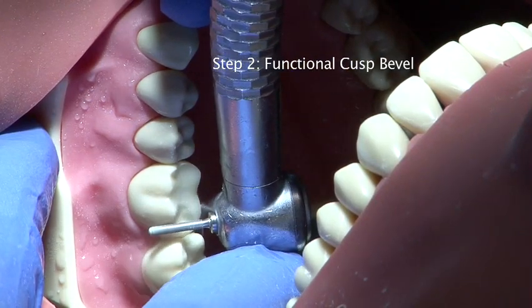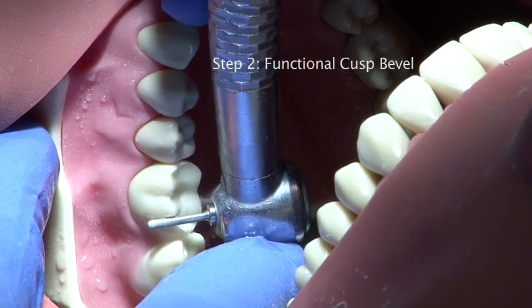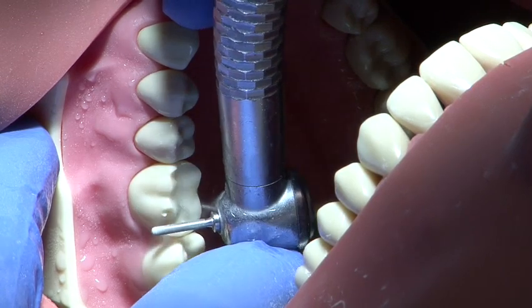The functional cusp bevel is carried out to a depth of 1.5 millimetres on the buccal cusp slope.